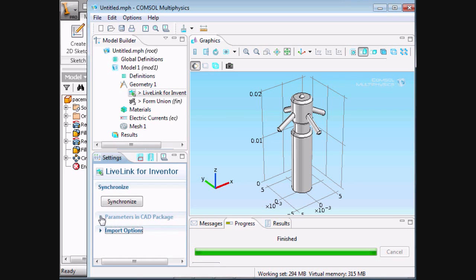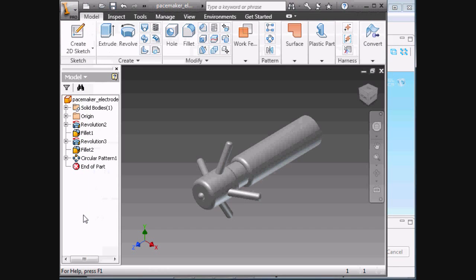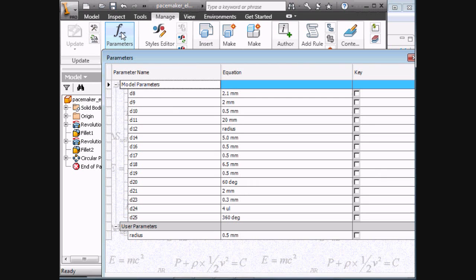We can select parameters to update in the CAD model, to update the CAD and to send it over to COMSOL. To know which parameters to change, we can go to Manage in Inventor, select Parameters, and there we see the automatically generated model parameters, and then the user-generated user parameters. In the user parameters, we see the radius is defined as 0.5 millimeters.